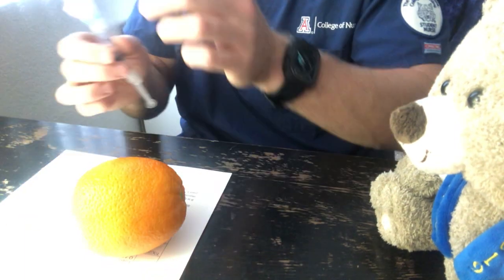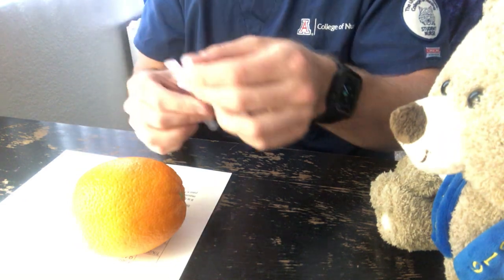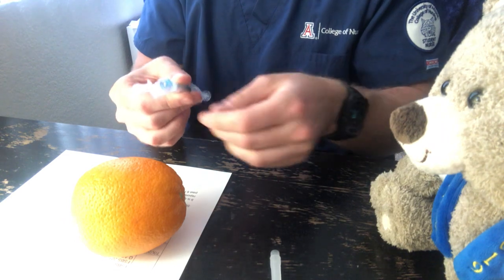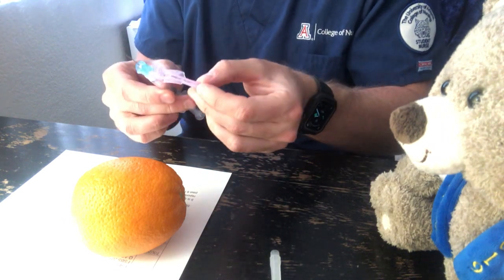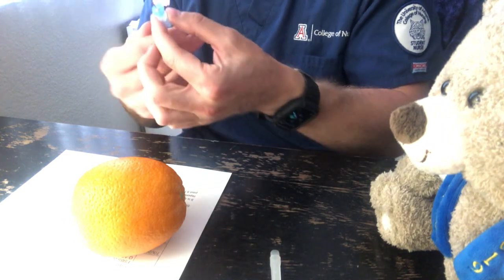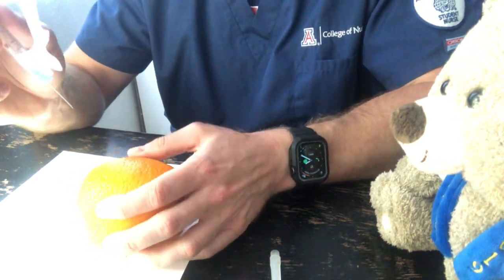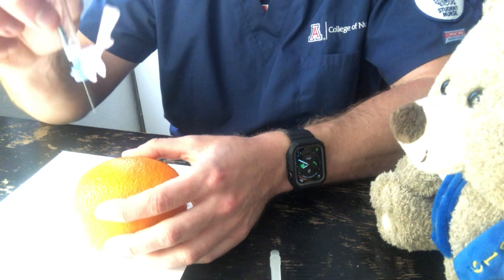I'm going to uncap my needle away from me. I'm going to pull the safety out of the way. I'm going to go in. Instead of pinching, I'm going to pull taut at the vastus lateralis.